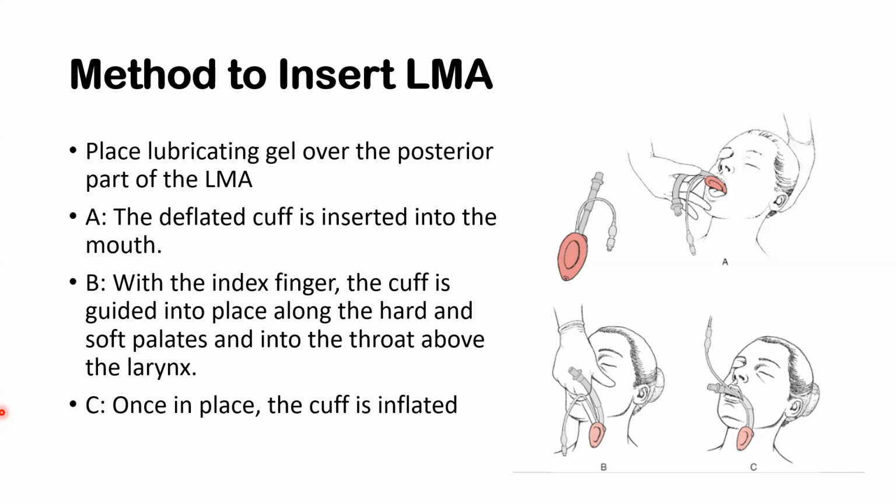Then when you push until you feel resistance at the back of it, make sure you have reached the area. Then you inflate the balloon as necessary. It means not to the left or right, it goes to the middle. It goes in the middle.